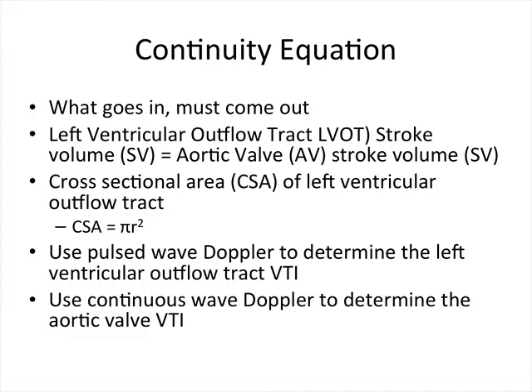Pulse wave Doppler allows the echocardiographer to choose the location of the sample volume. The cursor is placed at the same place that the radius was measured. This is close to the aortic annulus within the left ventricular outflow tract. The velocity profile is traced with the electronic tracing caliper to measure the left ventricular outflow tract VTI.